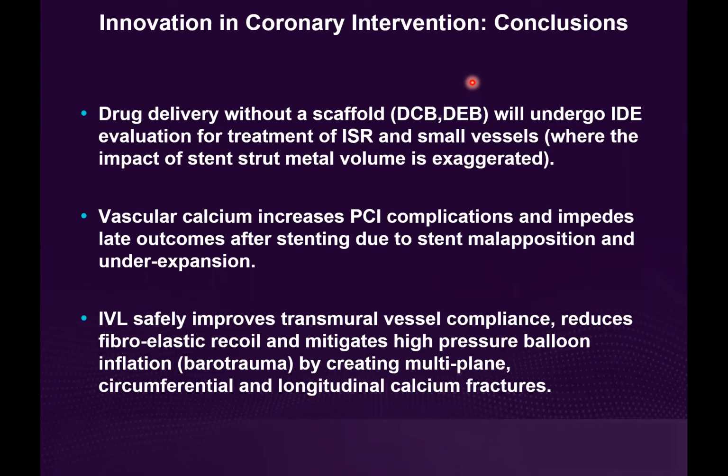Okay. So Dr. Kereiakes, all of these trials that you mentioned that pit one stent technology against the other often enroll patients who have stable angina or unstable angina, or maybe low risk non-STEMIs. Do you think there are any caveats we should think about when dealing with similar lesions, but in a high risk non-STEMI or a STEMI situation? And do you think there are any caveats for stent technology in that?